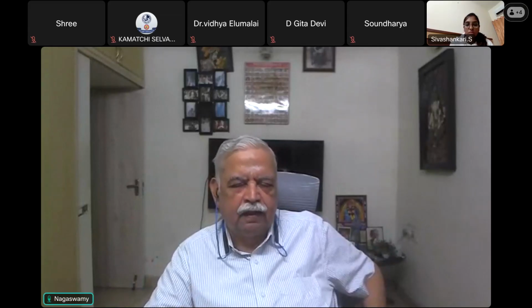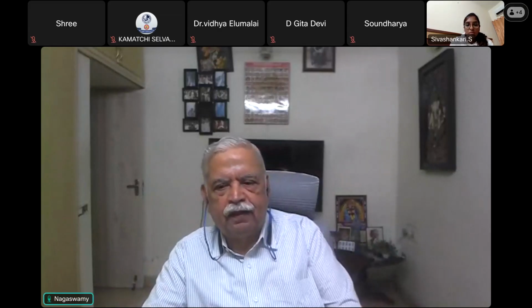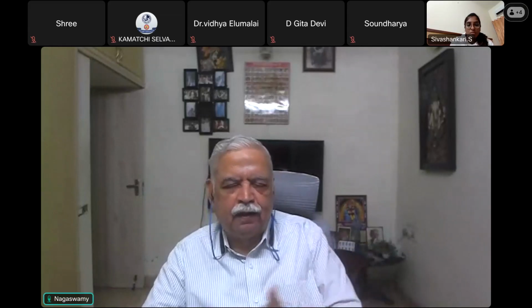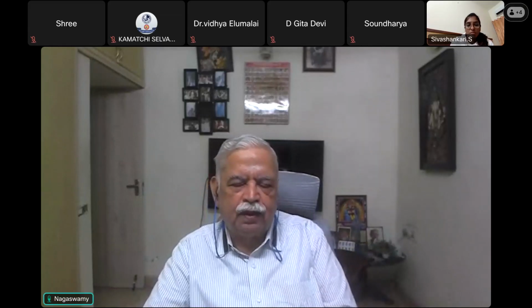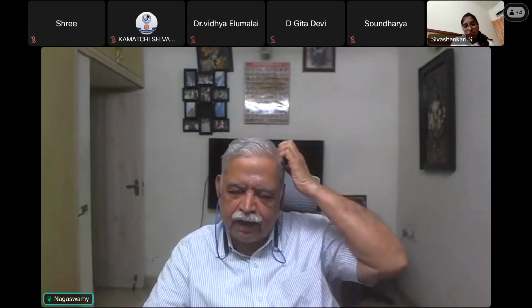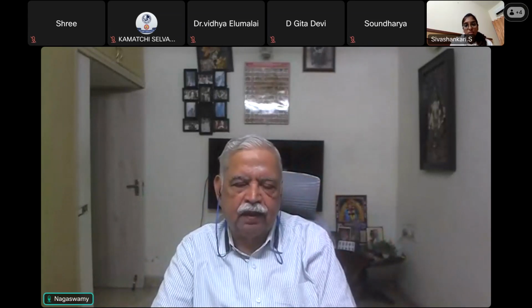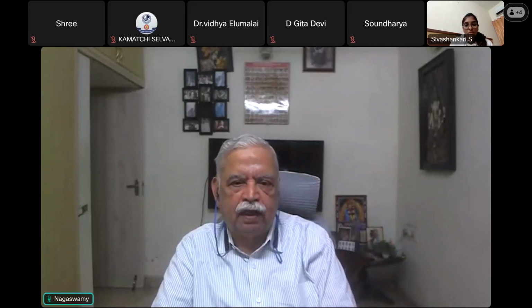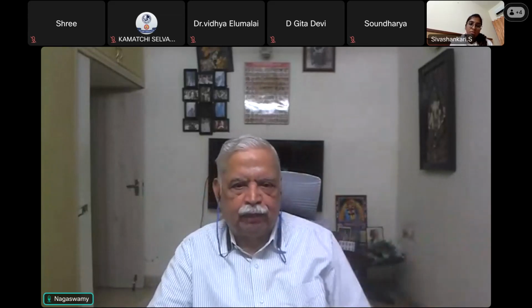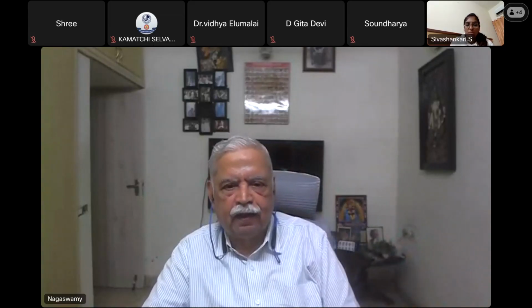Later on, anesthesia ventilators with bellows were introduced, which did the function of the anesthetist by squeezing the bag. Okay. So because of this experience, this was extrapolated to the use in ICU and critical care, where patients, because of some pathological conditions, came in a state of inability to maintain their oxygenation or eliminate the carbon dioxide, which condition is called type 1 or type 2 respiratory failure, which needed prolonged hours of support. So for that, they have to do the mechanical ventilation. Okay, this is the basis of mechanical ventilation.